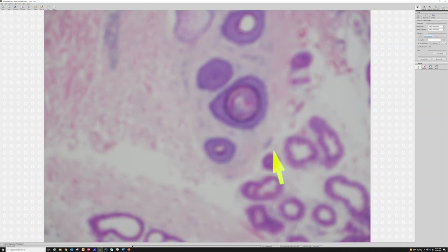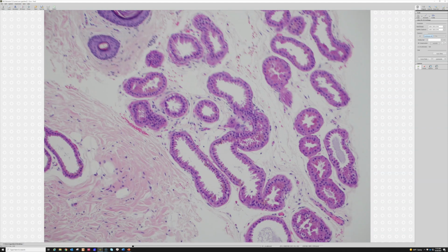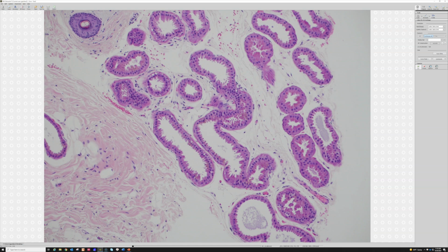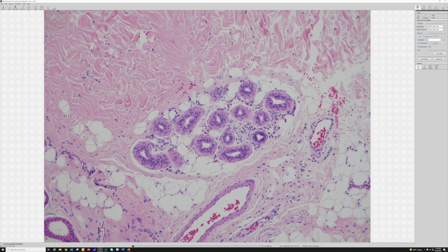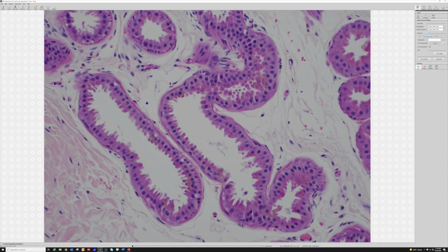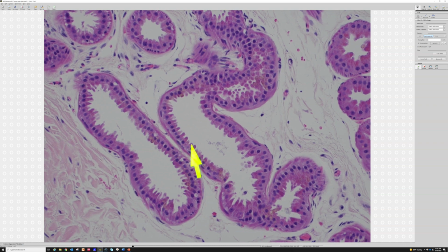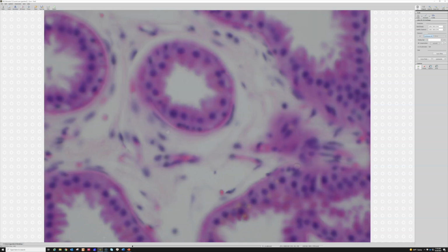And then the cells actually look quite different when you look closer, but from low power you can tell because these are very big, very pink, much more dilated. See? Eccrine, apocrine. And then the characteristic feature that everyone learns about apocrine is that they've got these little snouts, okay? They've got these little apocrine snouts or little kind of noses or finger-like projections protruding into the lumen of the gland space.